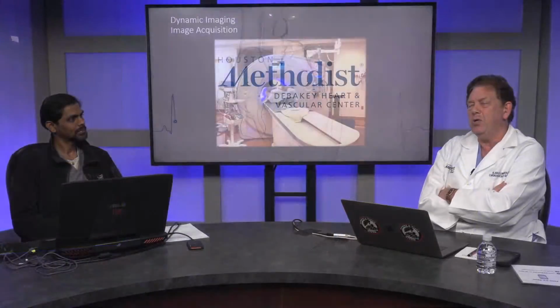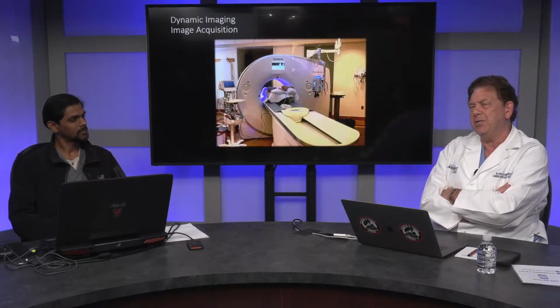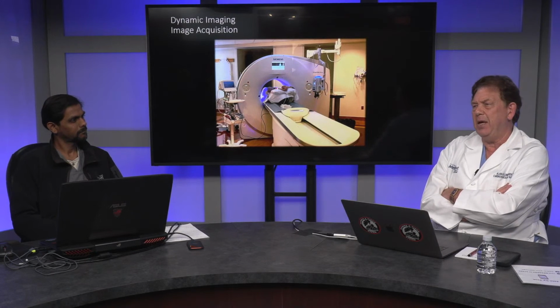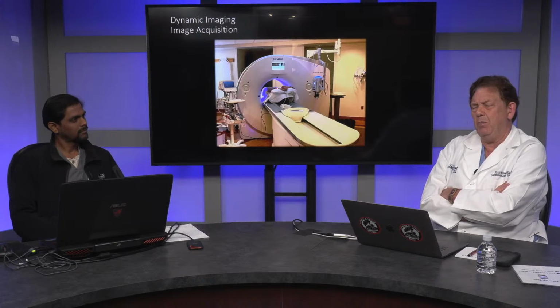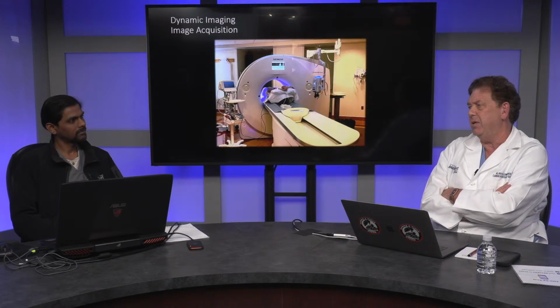Now, do we use TEE? Do we use TEE with color flow? Yes, we use TEE in essentially all dissections. It doesn't really show you the entry point though, because that's in the kind of blind zone for TEE. We mainly use it just to check where the wire is. It's obviously used in type A dissections fairly significantly, and when they're coming off pump, but we're not really using it to validate what we see in these dynamic studies.